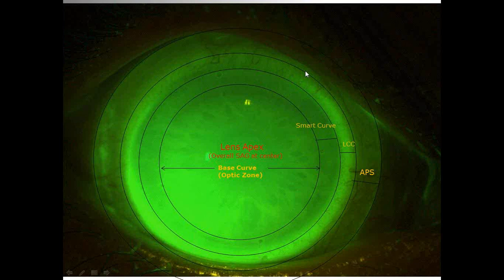At the end of the day, I'm not fully convinced that we have to completely clear the limbus at all times. I think that a lens which at initial fitting shows good limbal clearance, but with settling in time shows that it can actually gently touch the limbus. We just don't want to create pressure on the limbus. So I would look for staining at follow-up, as you had mentioned already too, John. If we take off the lens, if we see staining around the limbus, then that's a concern, of course. But thinning of the fluorescein in a couple clock hours, especially if you can pull the lids up and get that fluorescein to extend into that area, or if the patient looks free of staining and has good comfort with the contact lens, I think we can monitor that and live with it.